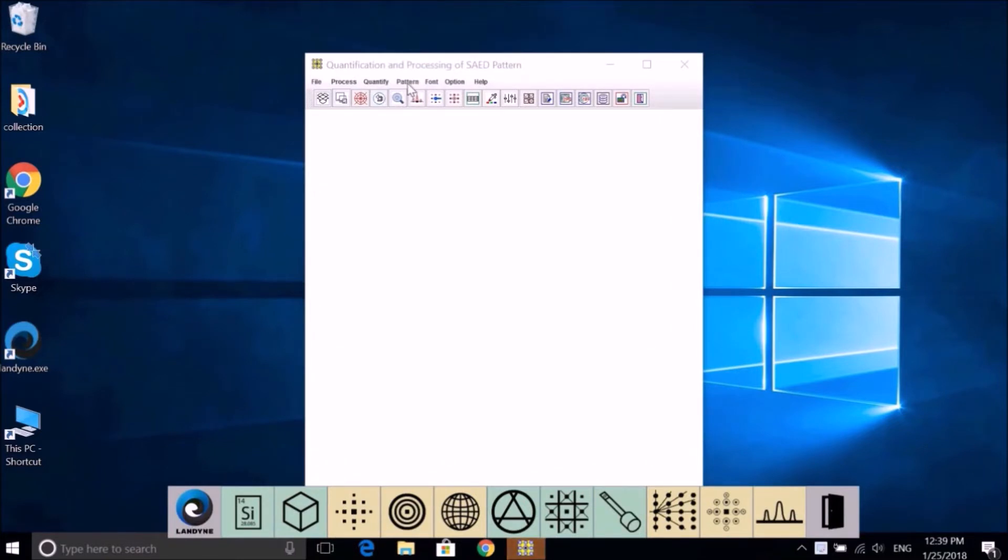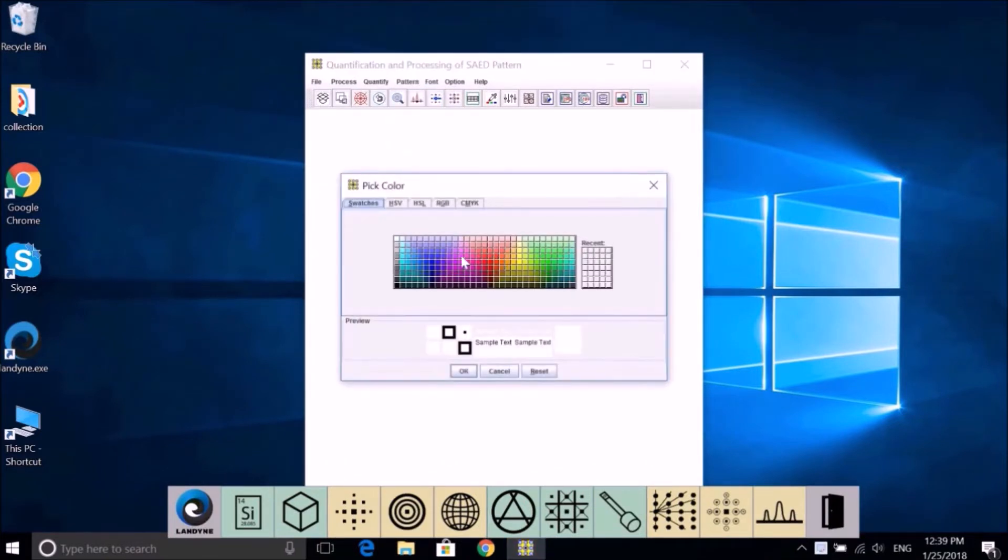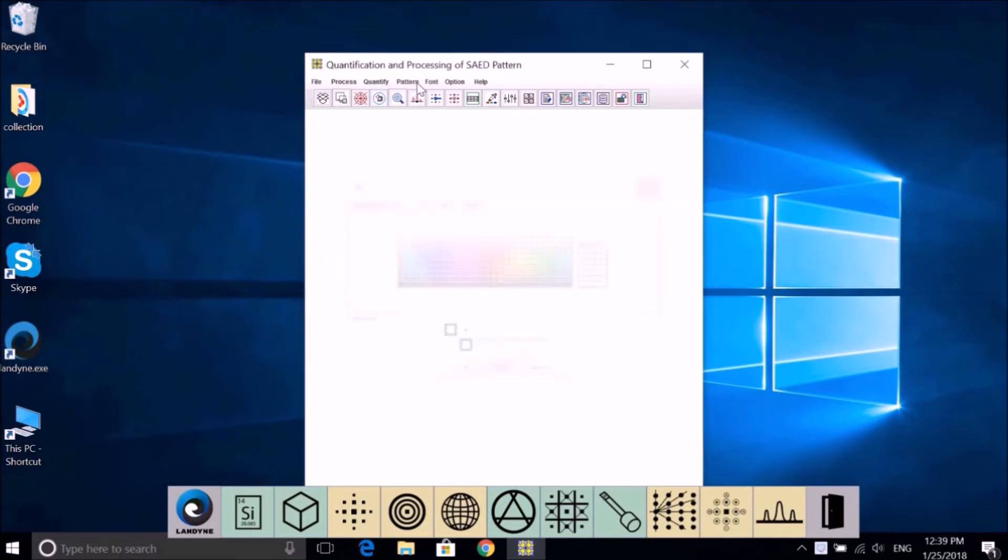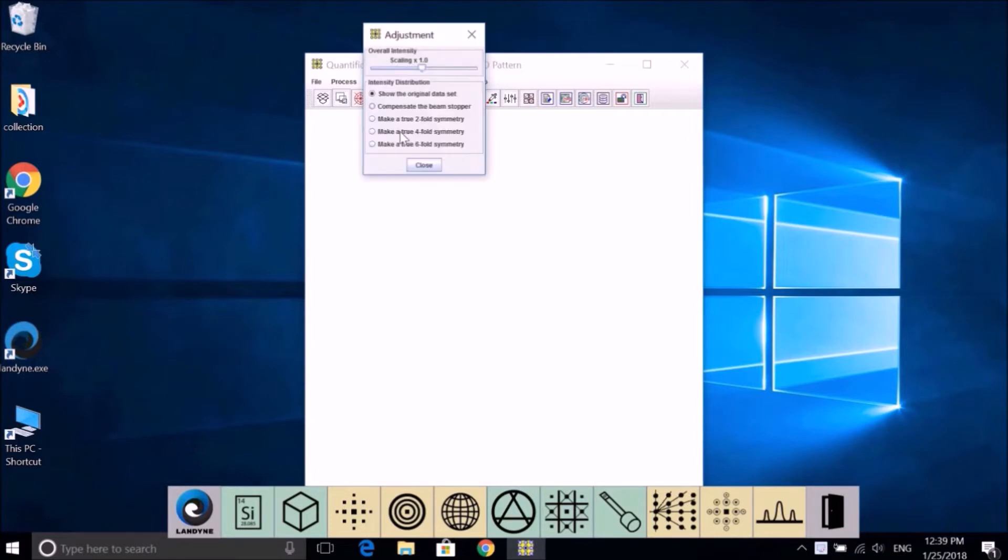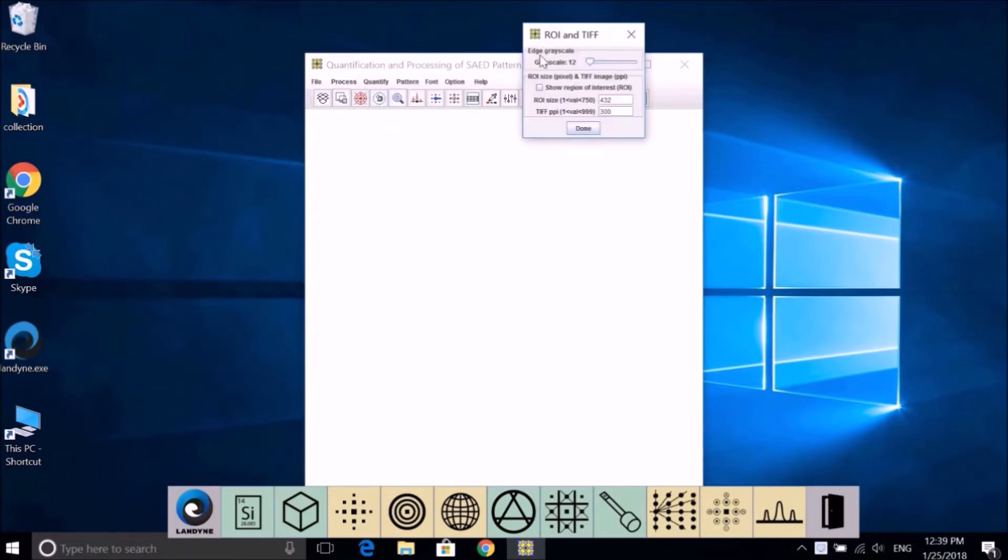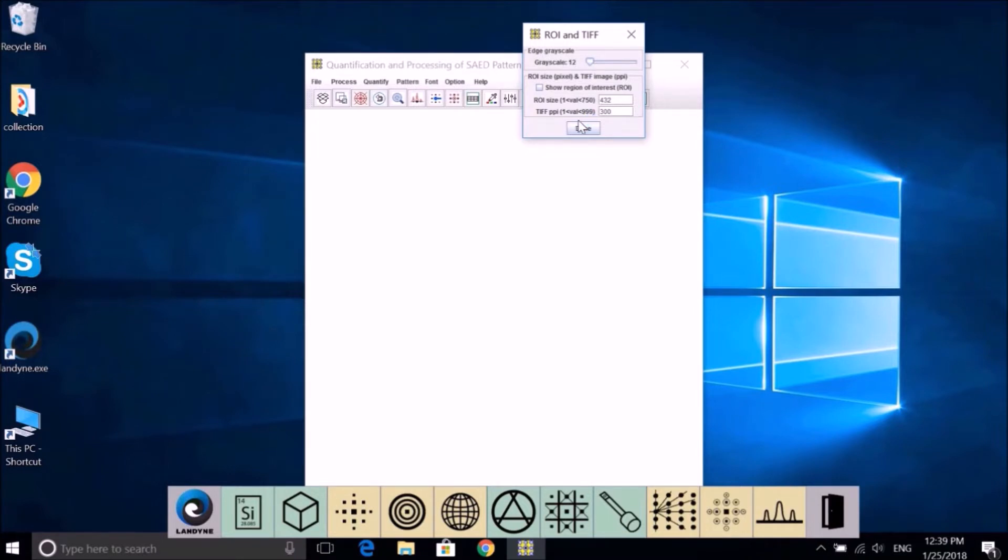Pattern - the color will show the pattern, the retrieved intensity. Adjustment for you to restore the true symmetry of the pattern. ROI and TIF control the size and resolution of the output.